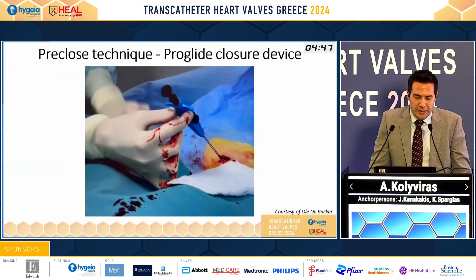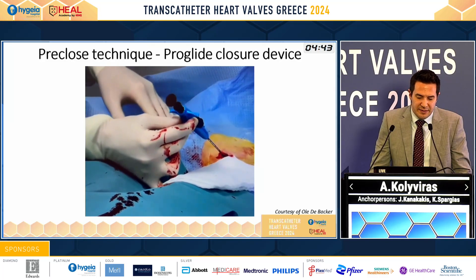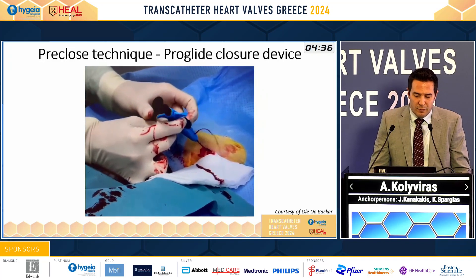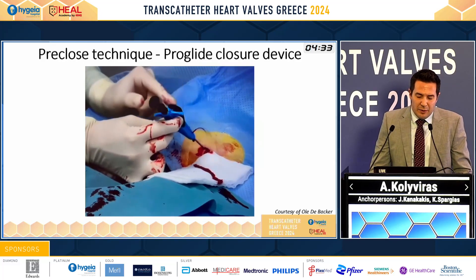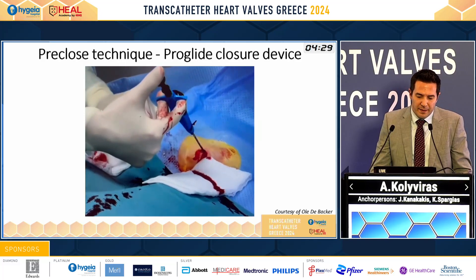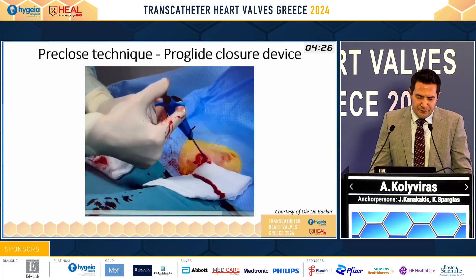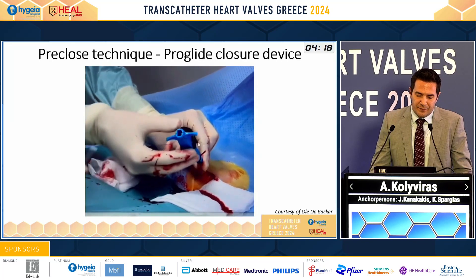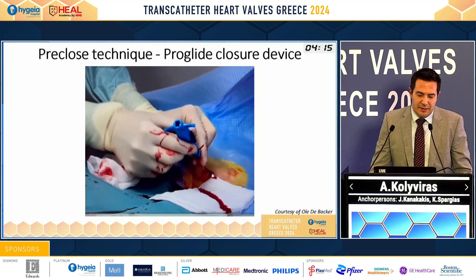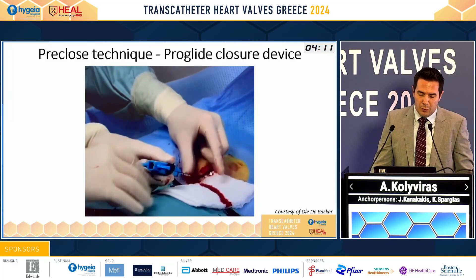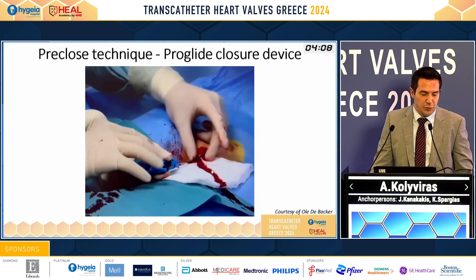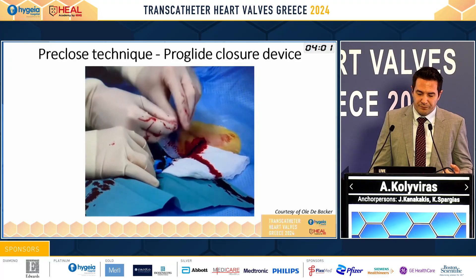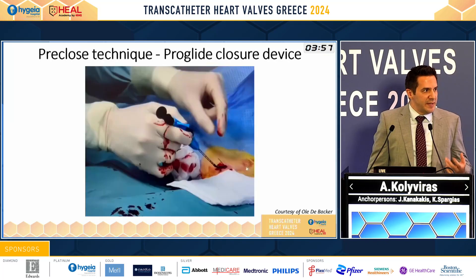This is the beginning of our procedure. We pull back the guide wire, keep the 45 degrees, and advance the ProGlide. This is a very simple technique. When we have back bleed, we rotate the lever, pull back the device, and break down the suture and cut it. We close the foot inside the vessel and bring back the device. Afterwards, we pull back and take the two suture ends — it is one suture with two ends. We bring them together with a clamp and continue with the second ProGlide.